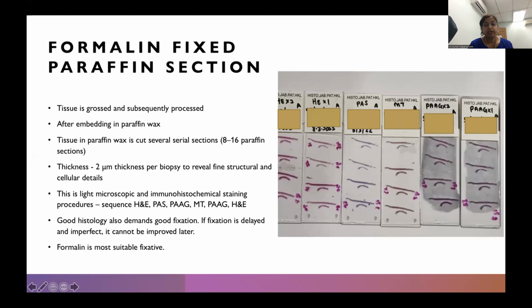If we just look at it like any other biopsy, with 1 or 2 levels, we miss it. So that's the reason we do so many levels, and with different special stains you identify different components like sclerotic areas, active lesions, and necrotizing lesions. All these things are seen in the various stains in different manners.